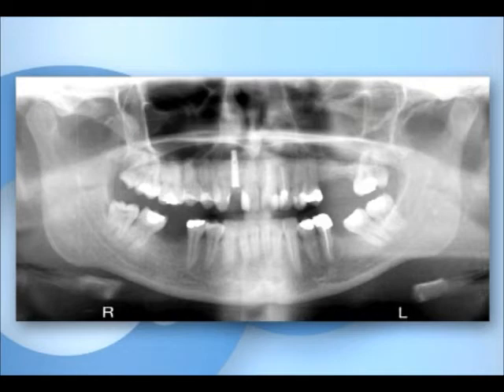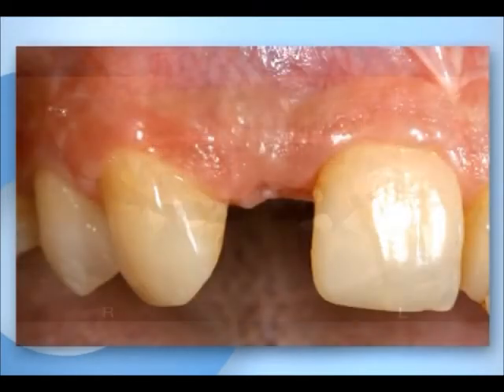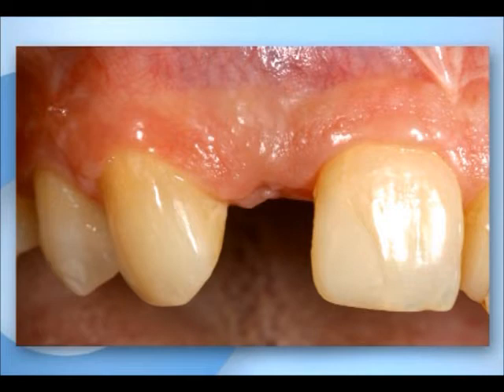The panoramic x-ray shows complication-free integration of the Camlog screw line implant after three months of healing.